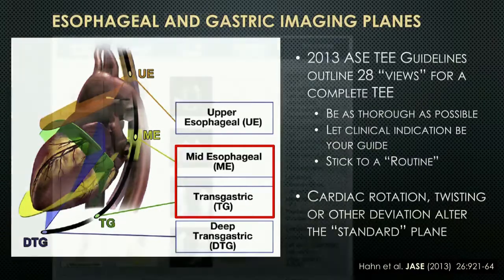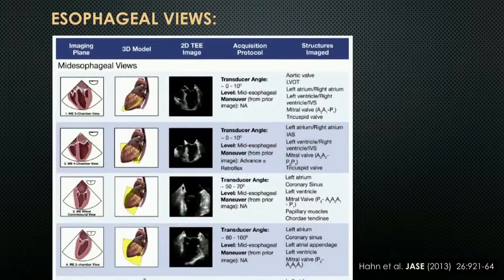So don't fixate, in clinical life at least, on, oh my God, it's 60 degrees. I have to be seeing this at 60 degrees. Why am I not seeing this at 60 degrees? What you're going to get on the exam are going to be the standard type stuff.